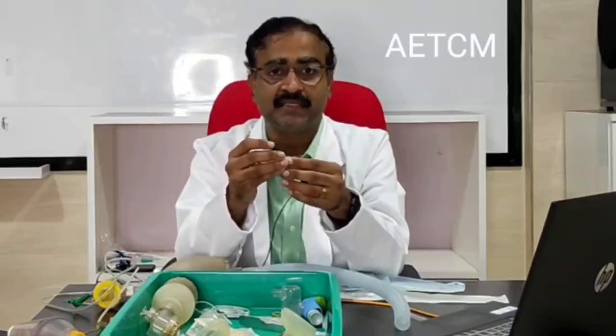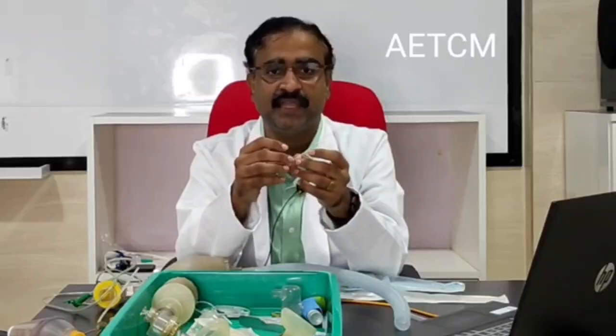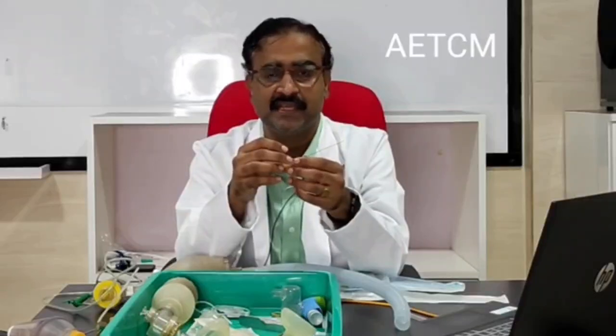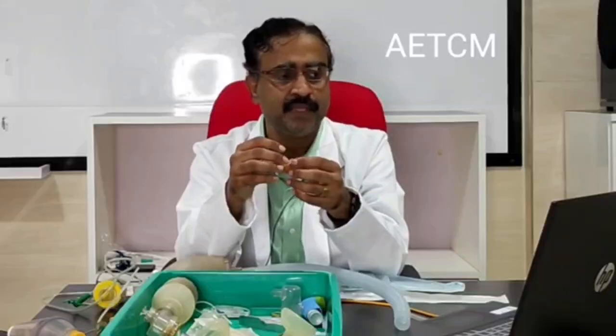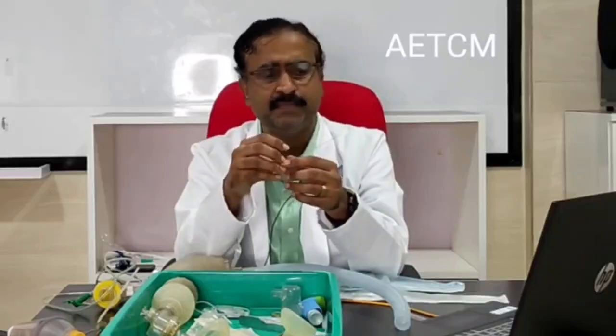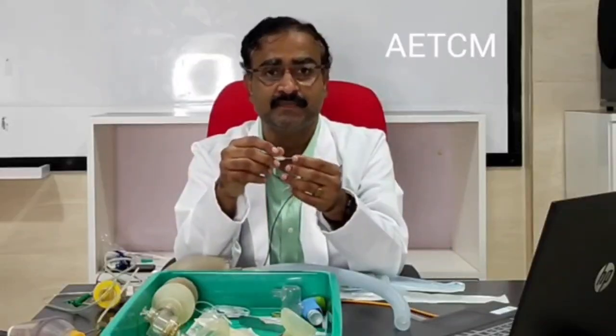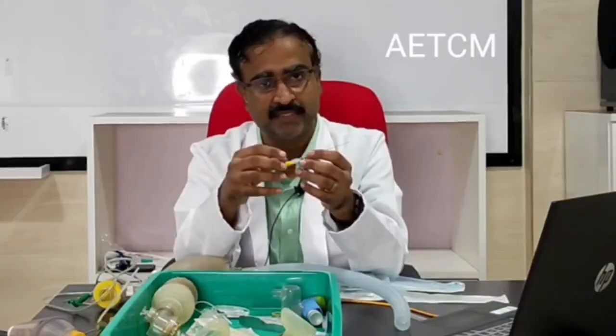Like the word lumbar puncture, it is definitely used in the spaces of the L3, L4 or the L4 and L5. The lumbar puncture is done in a child in whom we suspect meningitis or meningoencephalitis. The child has to be kept in a fetal position in the left lateral position traditionally. In some cases, they can be also kept in a sitting position. Now that is done in babies in whom we can hold them in a sitting position where the backs become very rounded, and so doing the procedure becomes very easy.